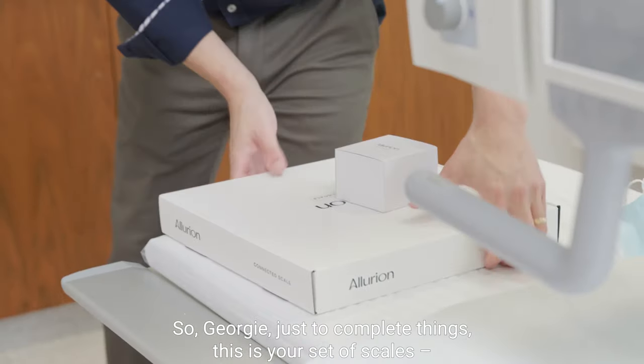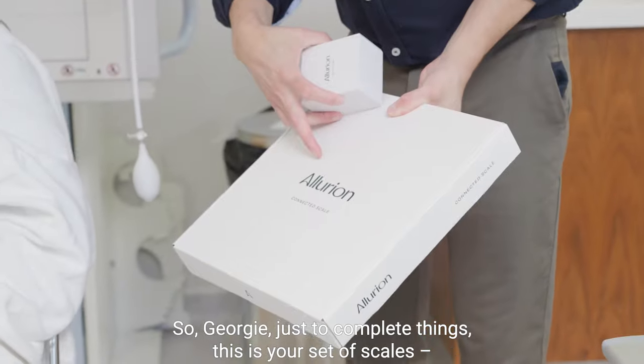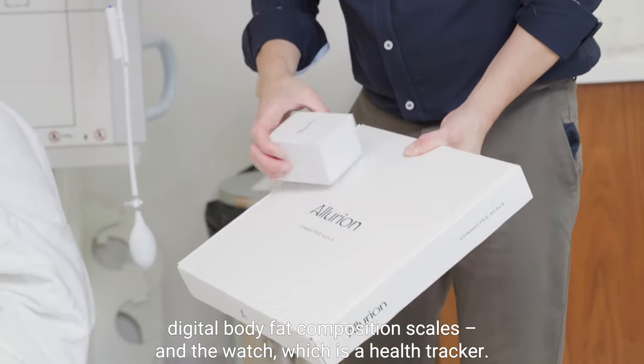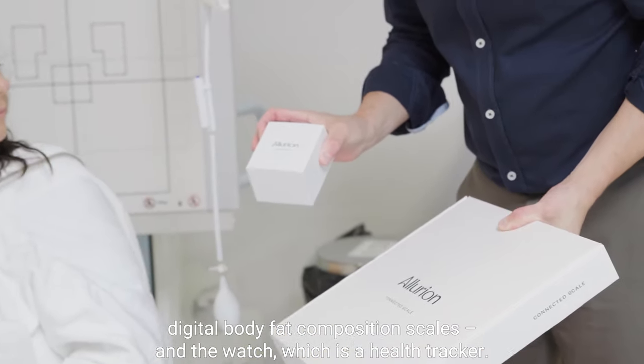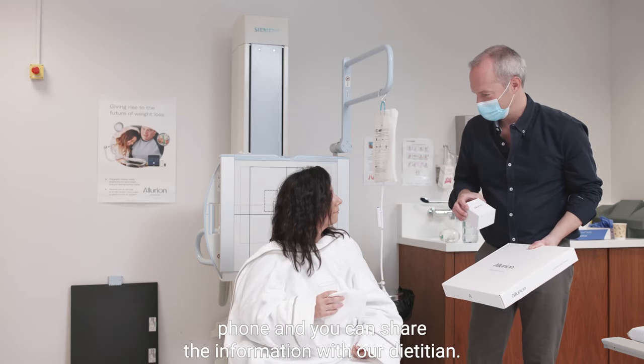So Georgie, just to complete things, this is your set of scales — digital body fat composition scales — and the watch, which is a health tracker. All of these act via the app on your phone and you can share the information with our dietitian.